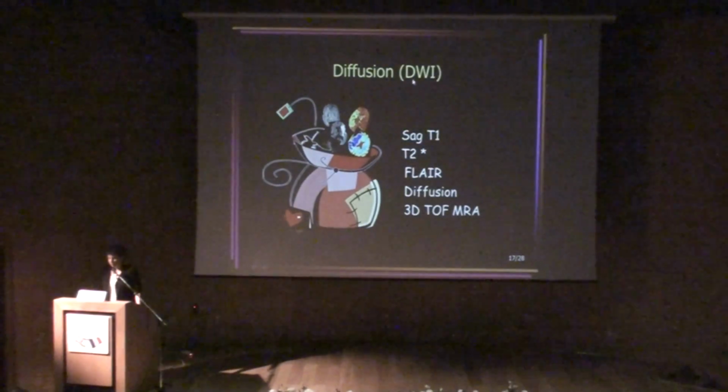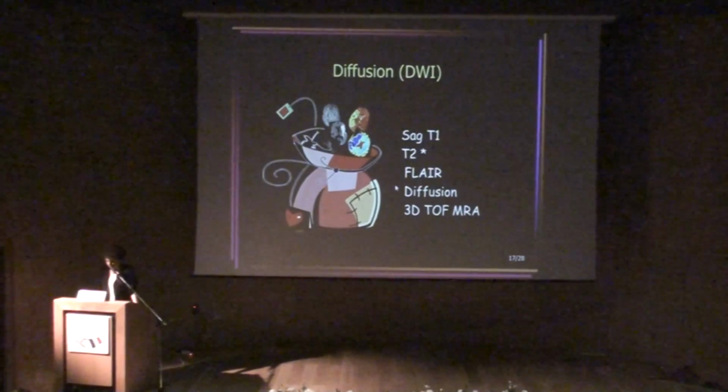Okay, a few words again about diffusion-weighted sequence, because I didn't tell you everything before.